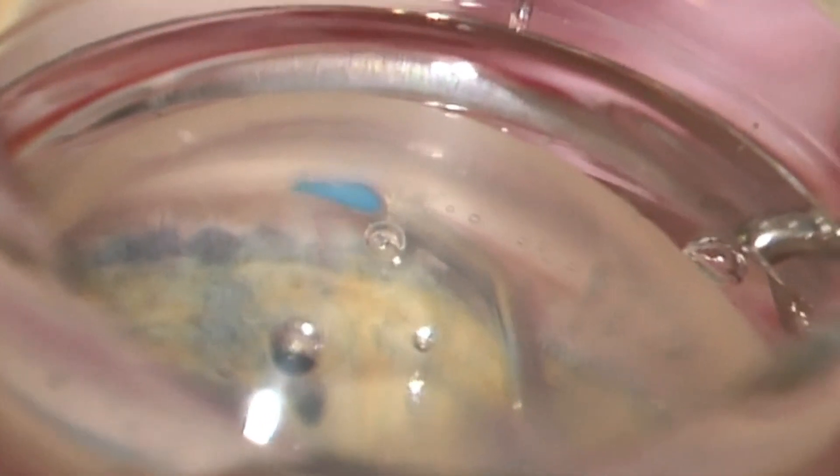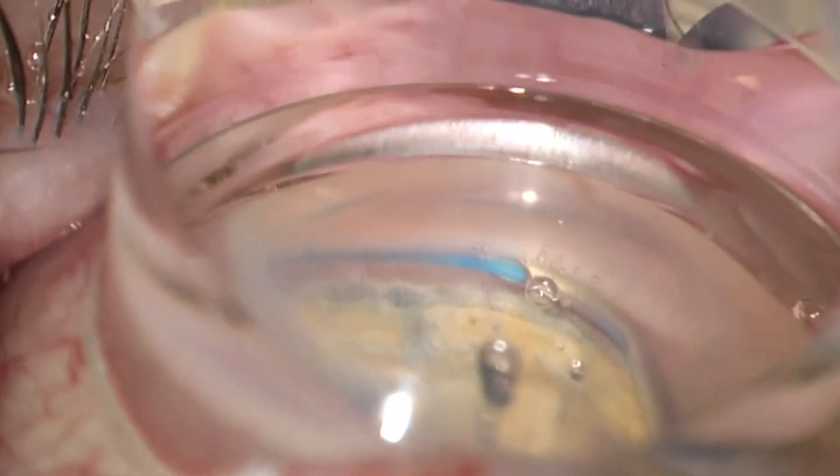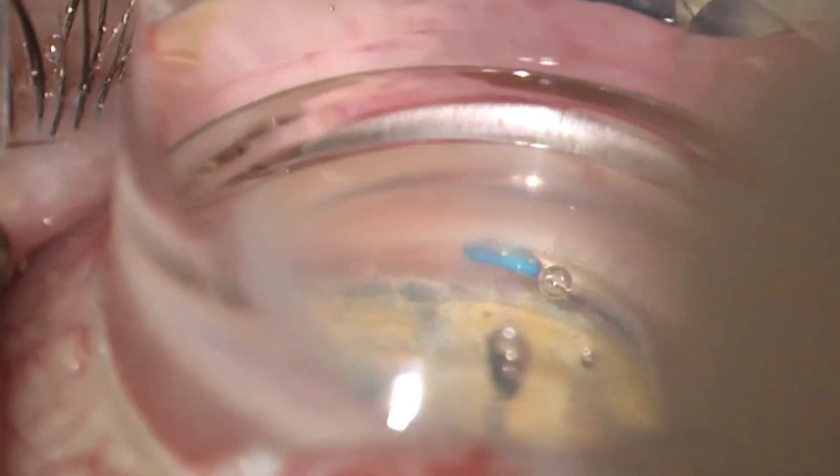I found using the Omni system fairly easy, having had previous experience with canal-based surgery. Reflecting on training residents and fellows now, the feedback I've had from observing them is that this is not a particularly difficult procedure to learn. It's very much like placing a cannula into a vein — you have tactile feedback, you can tell that you're in the right location, and you feel no resistance whatsoever. The learning curve is not particularly steep.